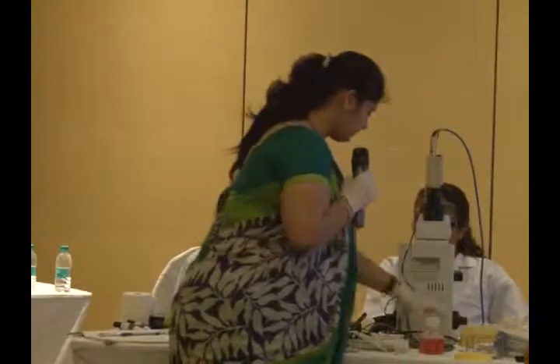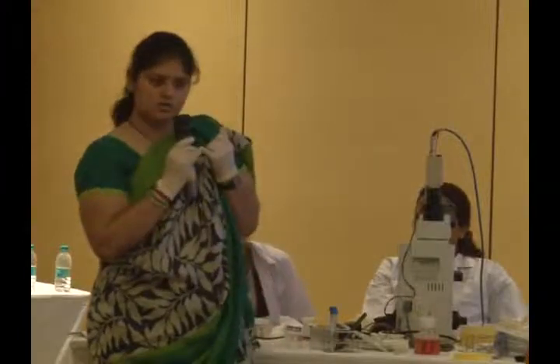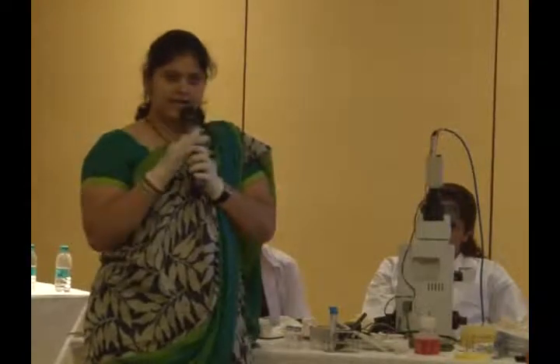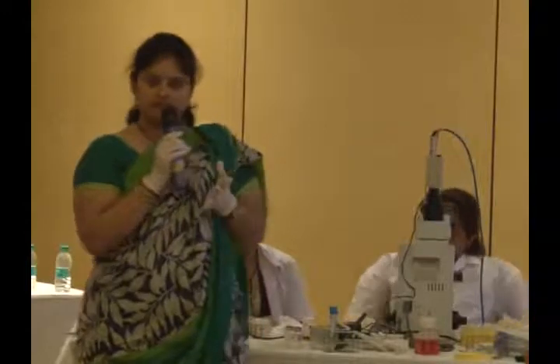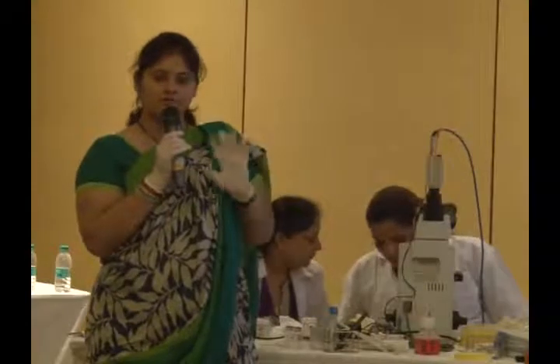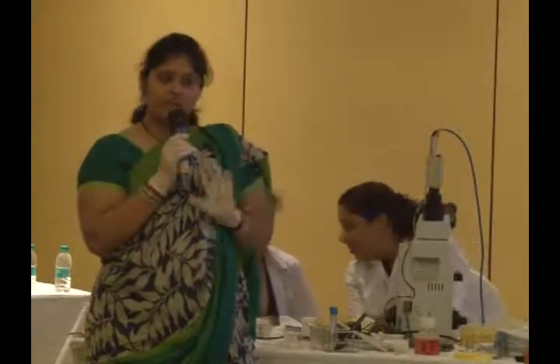And then we have media. There are two types of media. One is sperm wash. See, the name differs with the company, so the broad name is sperm wash. And the other is density gradient, which has different concentrations available in the market, readily available. One is 80-40, 45-90, 50-90, 55-80.